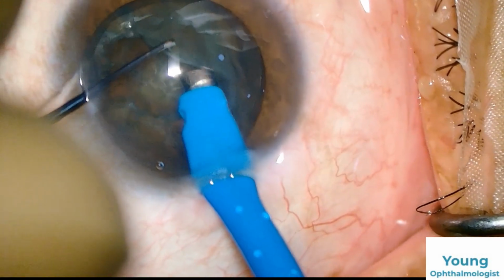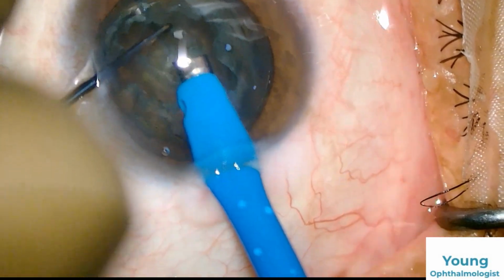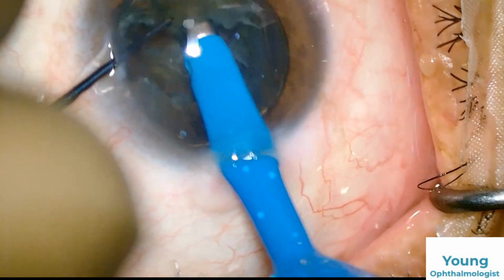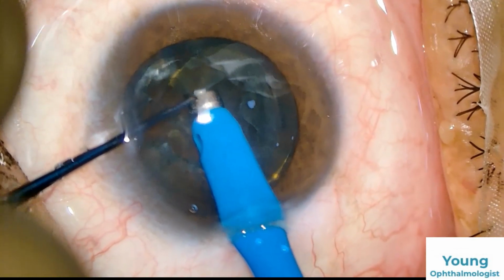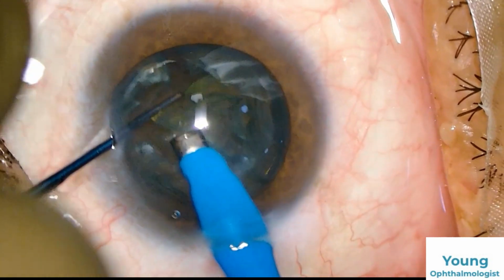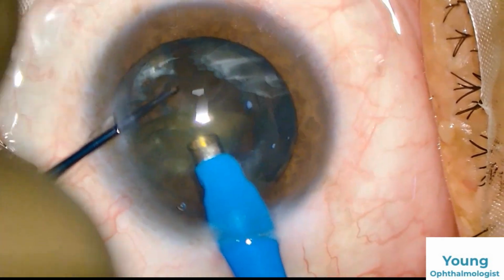You should also be ready to manage complications. Be prepared for patient movements, sudden blinking, squeezing reflexes, and don't hesitate to take out your probe if you feel you need to inject visco. It's okay to take out your probe 2-3 times in initial cases of topical phaco and push visco to give a proper space for phaco.